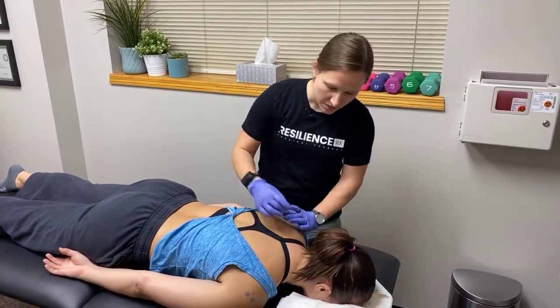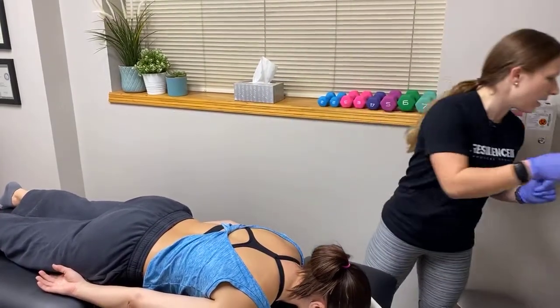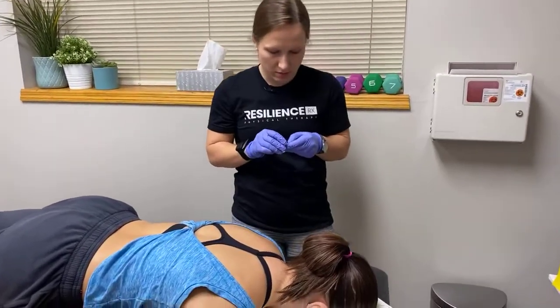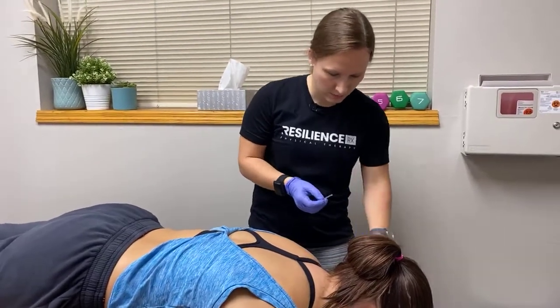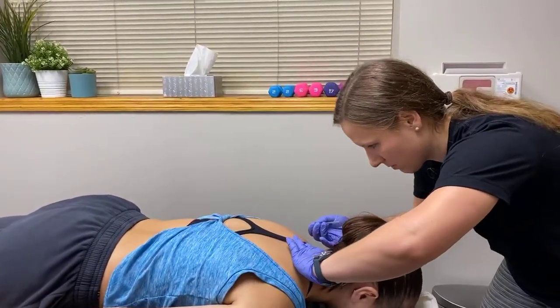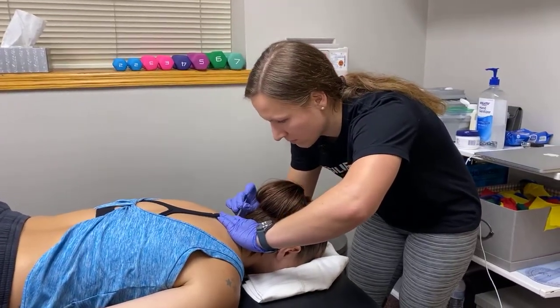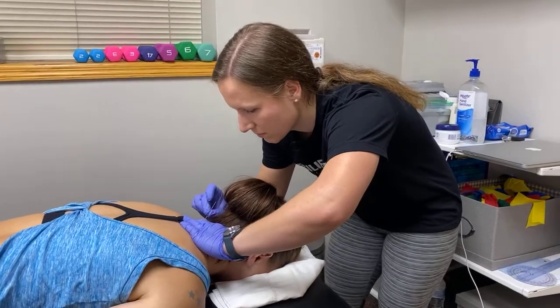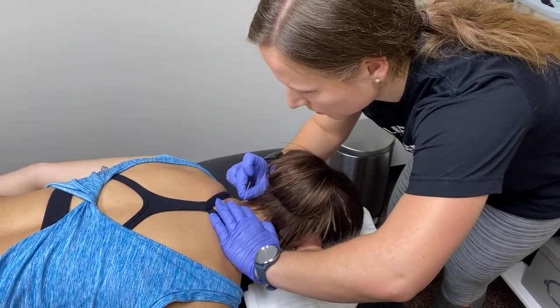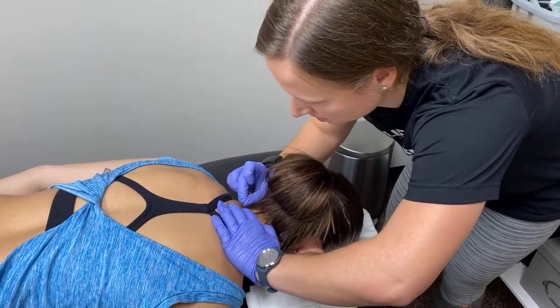So we will do this muscle, we'll do this, and then we'll hook them up with some E-stim. So I will grab these. We'll start with the neck. It's kind of tight in there. How's it feel on your end? Fine. Okay.